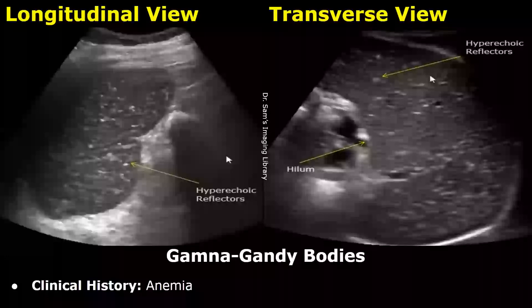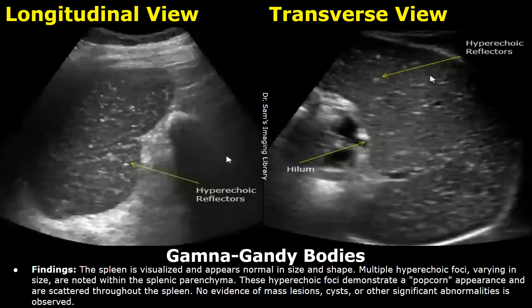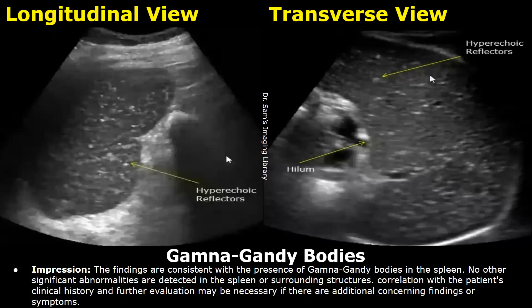This is a case of Gamna-Gandy bodies. The clinical history was anemia. In the findings, there are multiple hyperechoic foci which demonstrate a popcorn appearance and are scattered throughout the spleen. In the impression, these findings are consistent with the presence of Gamna-Gandy bodies in the spleen. Correlation with the patient's clinical history and further evaluation may be necessary if there are additional concerning findings or symptoms.